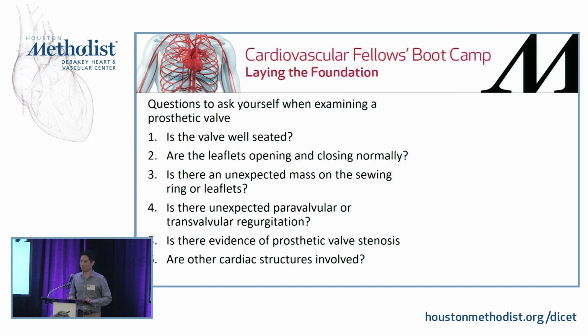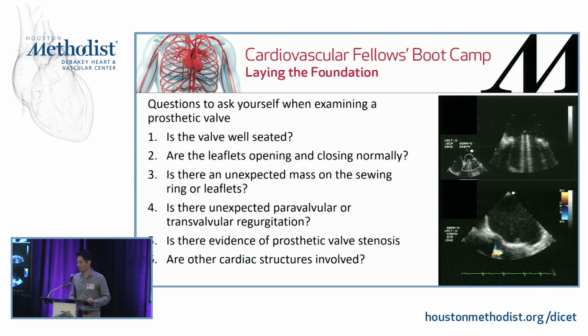Is there evidence of prosthetic valve stenosis? What we'll do is shoot a Doppler through the valve itself and come up with a gradient and effective orifice area, things like that, to make a determination on that. And finally, a good echocardiographer will look at everything else in the heart and make sure that nothing else is involved. So let's just ask ourselves these questions again.